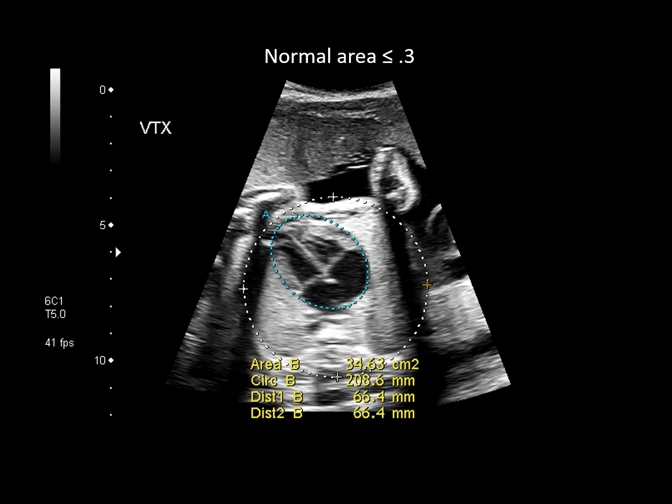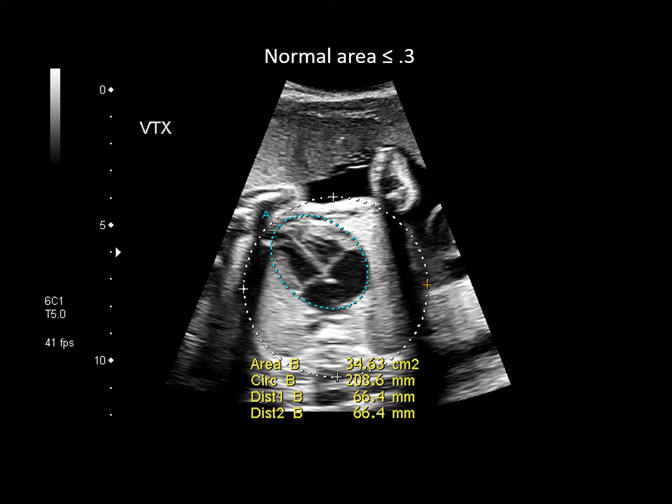We use the cardiac-to-thoracic size ratio — the area of the heart against the area of the thorax at the level of the four-chamber view. The heart should be about one-third of the internal size of the chest or less. Anything more than 0.3, or a third of the volume of the chest, would be considered enlarged.